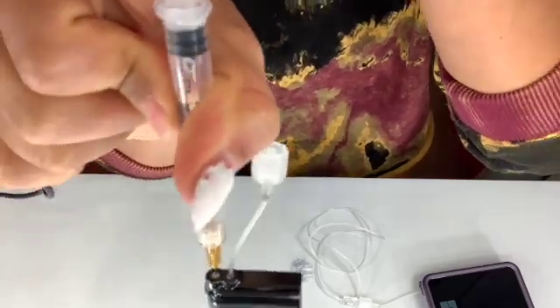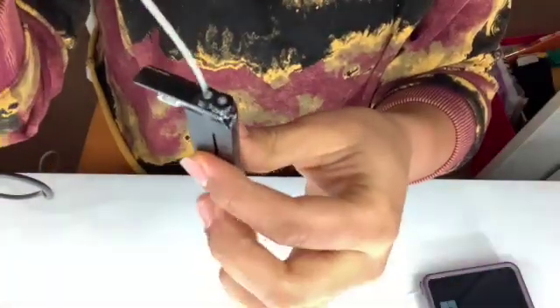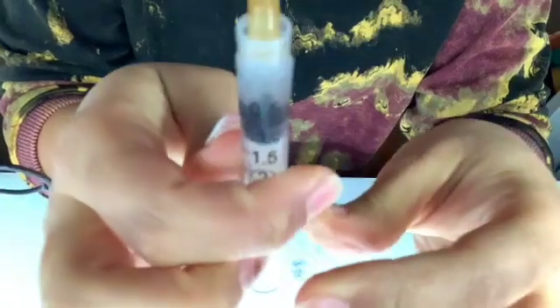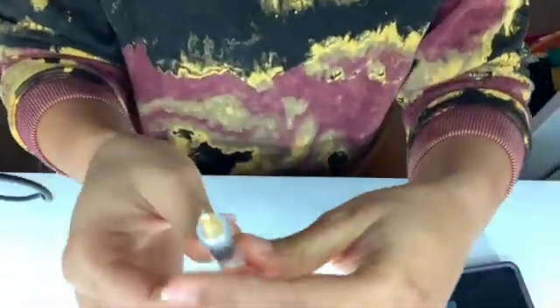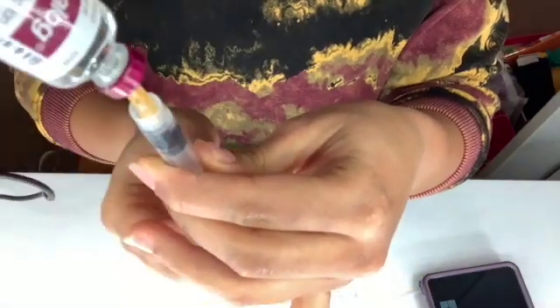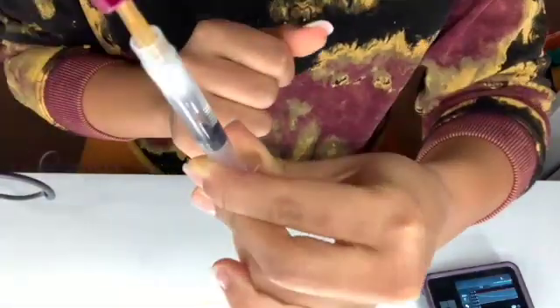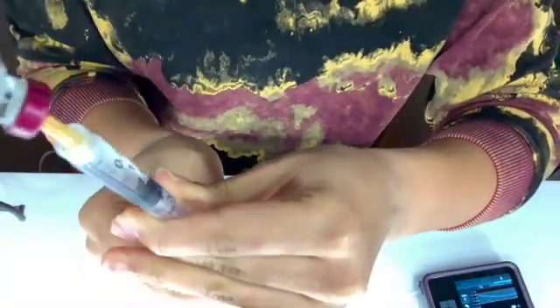And this is different. I did not have to do this step for my Animus pump, so this is the change. Just make sure you always get the air bubbles out of your cartridge. Then we're going to push the bubbles to the top and put the vial back onto the needle and push the air bubbles out. And now we're just going to fill it to the recommended dosage that your doctor told you. And make sure you get all the air bubbles out.